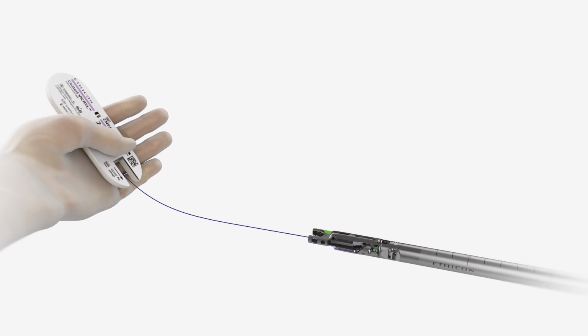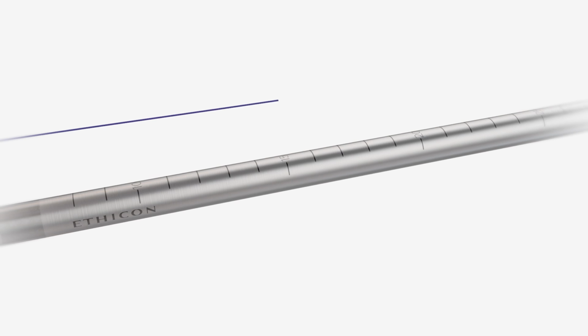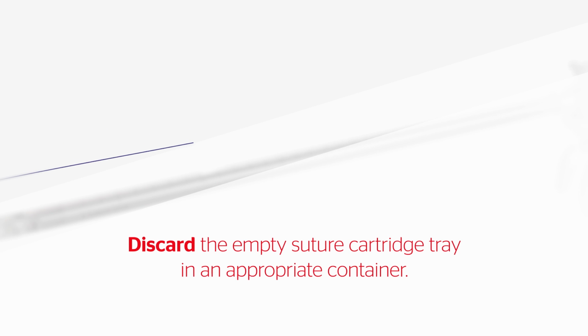Gently pull the suture out and cut the suture to desired length, if necessary. The scale on the shaft of the instrument can be used as a reference. Discard the empty suture cartridge tray in an appropriate container.